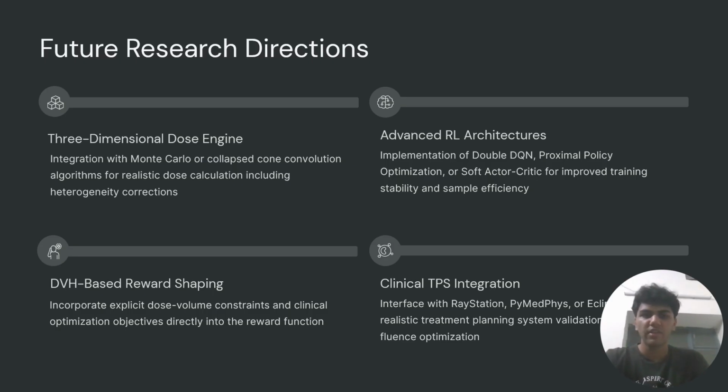And lastly, we can integrate this with real treatment planning systems. This will help in optimizing beams and the intensity, the beam angles and the intensity together. Basically, the model works, and now we focus on making it more realistic, more accurate, and closer to real world clinical use.